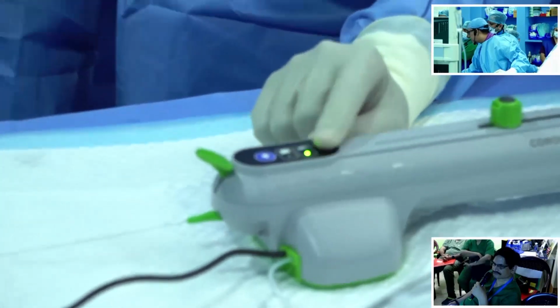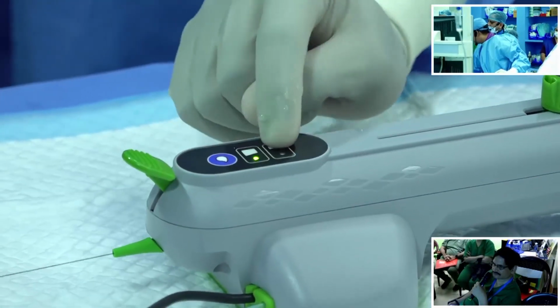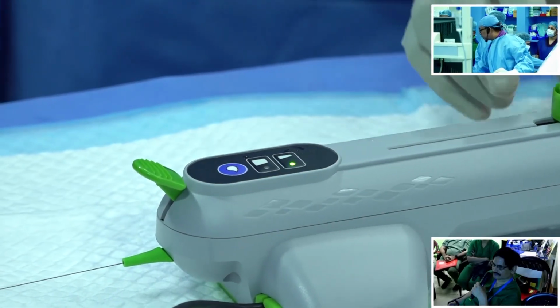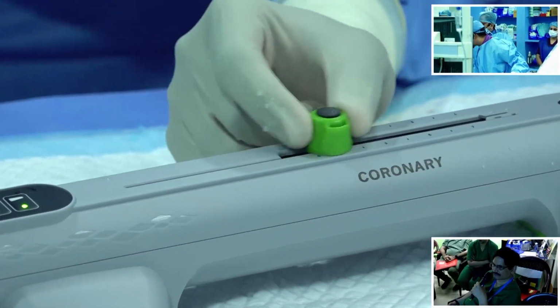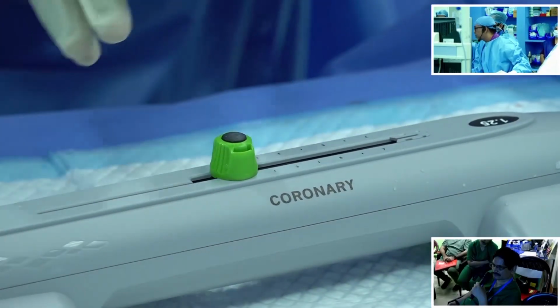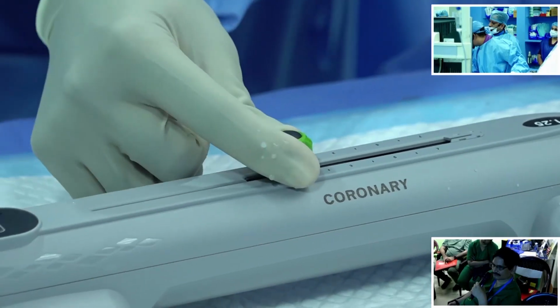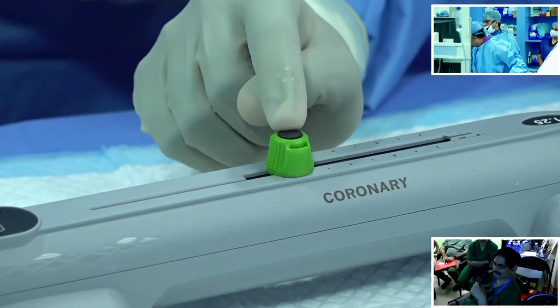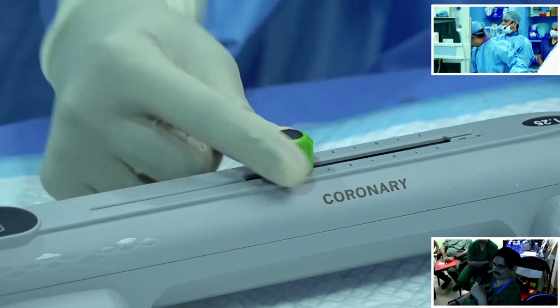This green light is for 80,000 rpm and this is for 120,000 rpm. We just have to check once with 80,000 rpm. Always keep the knob in the lock position. This is the unlock position, where you have the wings looking outwards, like the bird about to fly. The wings are wide apart. So this is the lock position, and this is the open position. When you do the burring, you keep the knob in such a way that the wings are in open position. Here you have the wings in the closed position.